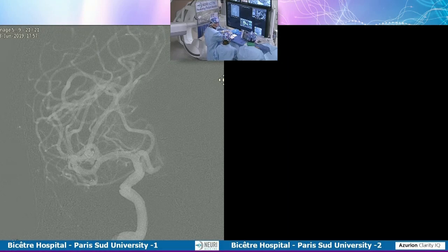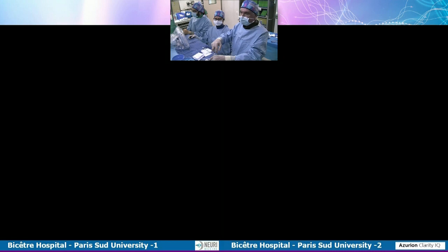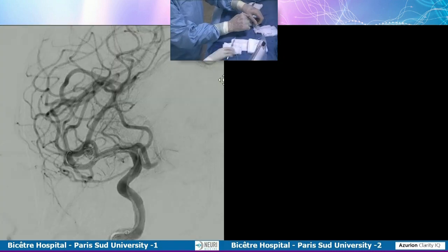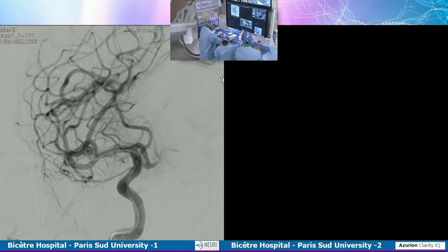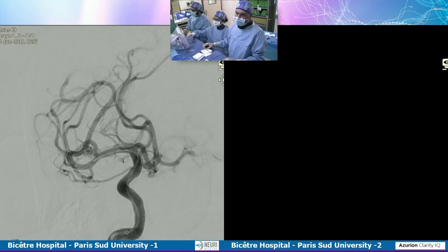Okay. And the other question in this particular case to Adam: would you do endovascular? Would you clip this? Non-dominant hemisphere, MCA, small, pointing there, he's got that little daughter, which is problematic. You know the answer. So Laurent says he's here for stupid.